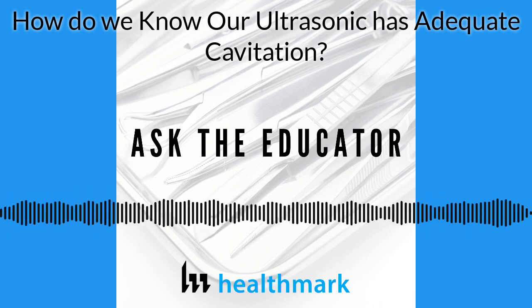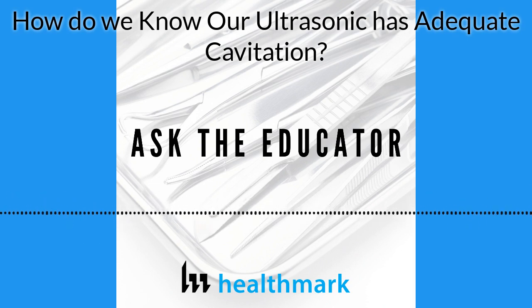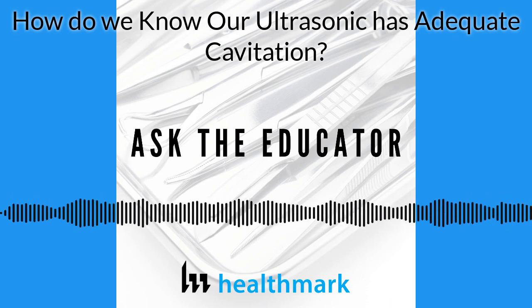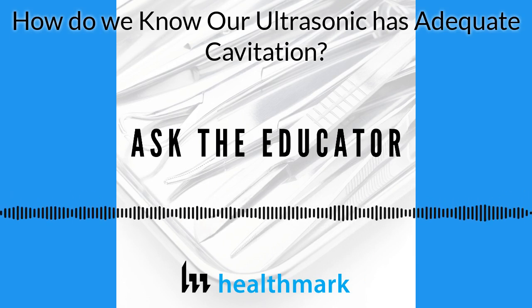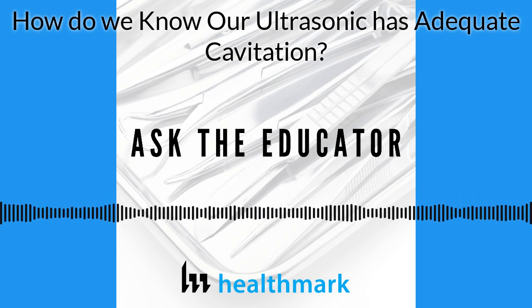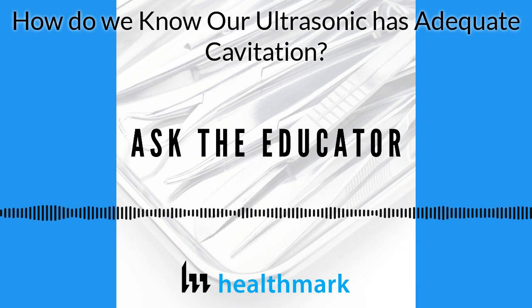So if those transducers aren't working, it just becomes an expensive soaking tank. So you buy the sonic for its ability to create cavitation. Thus, you need to check for, is it really producing cavitation? Because if not, it is just an expensive soaking tank. Did that make sense to you, Kevin?